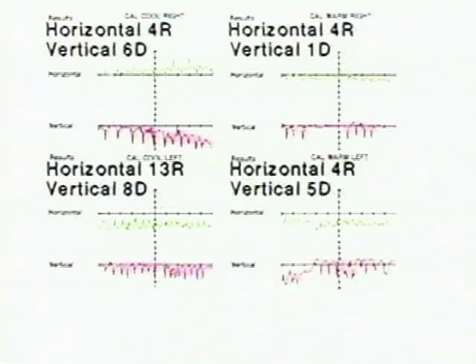The next patient demonstrates a central type vestibulopathy where there is failure of fixation suppression. In this particular patient, we also see a marked vertical nystagmus, which is also indicative of a more central type pathology than peripheral. In these particular patients, it is again of extreme importance to be observing the nystagmus pattern and the absence or presence of nystagmus when fixation suppression maneuvers are carried out.